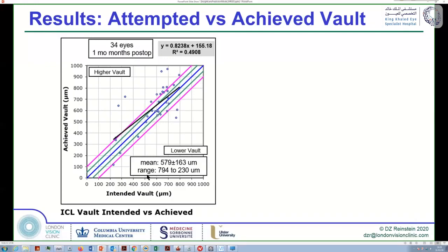We now have a lot more, actually. It's time to update this. But this is now prospective data, okay? This is eyes that we used the formula for that were not used to develop the formula. And we have about 50 or 60 eyes now, I think, to date, where we have used this prospectively. And here's what's amazing, okay?